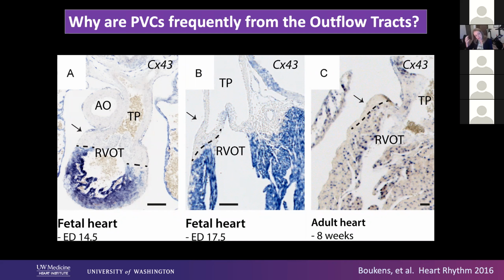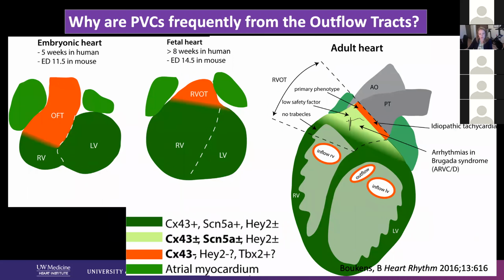And when you start to think about it that way, and then also think about the anatomic relationships, these aren't molds, right? They're not solid sheets of muscle uniformly lined up in the outflow tracts. These are very complicated areas where heterogeneous tissue is coming together. And it helps you understand why you can get some funny results, or maybe not have completely straightforward mapping in terms of activation.